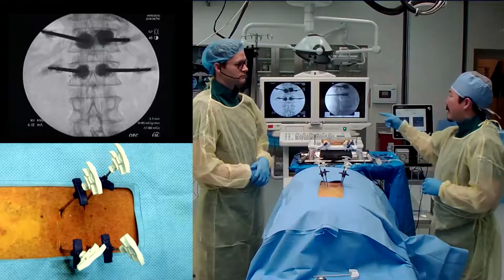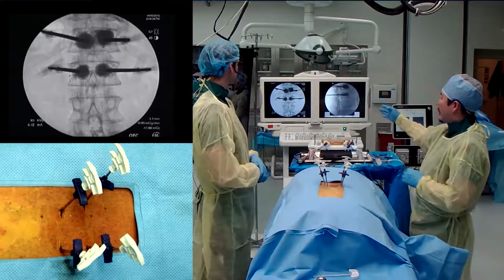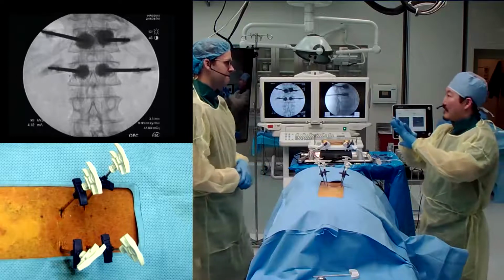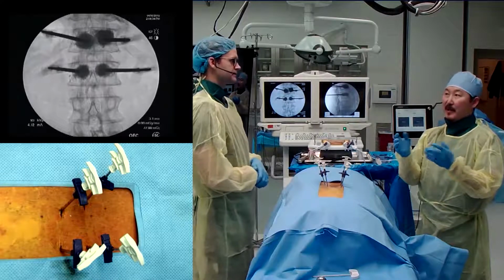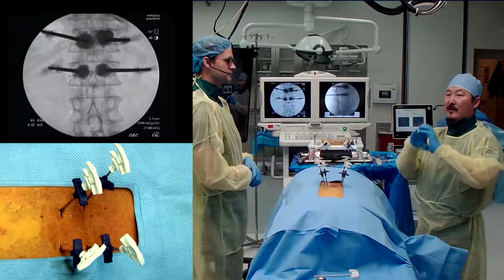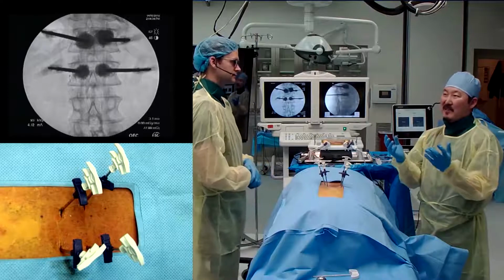To tell you quite honestly, that fill pattern right there, where there was just a little bit, is interesting because it follows the venous plexus. What's probably happening is we got a little bit of cement in the venous plexus, but as long as you don't have a large space-occupying lesion within the spinal canal, it typically is not that big of a deal.